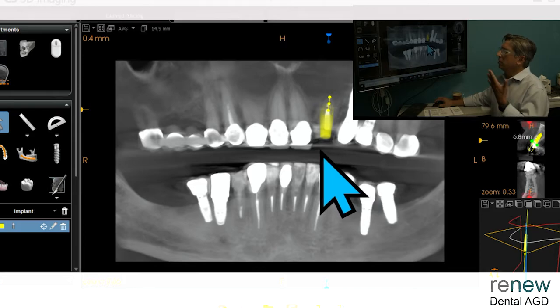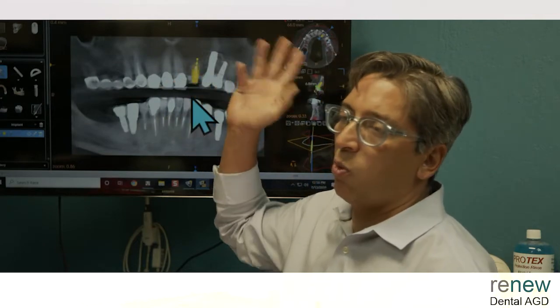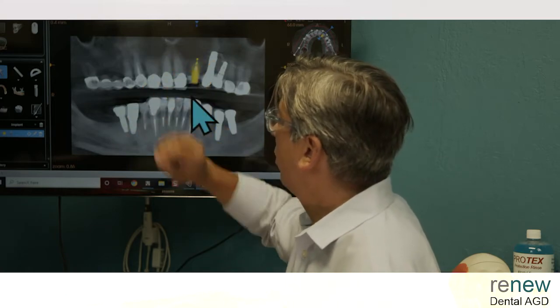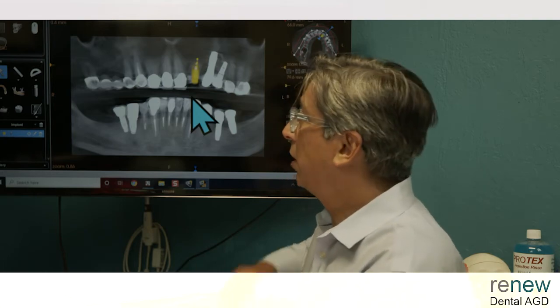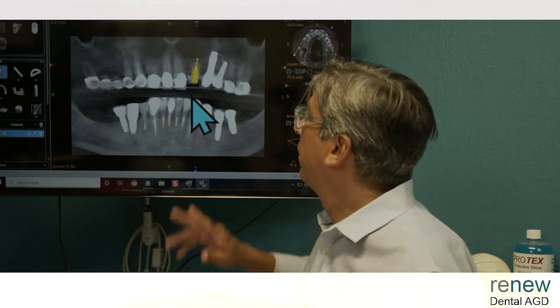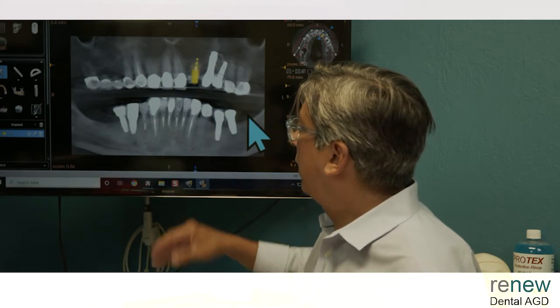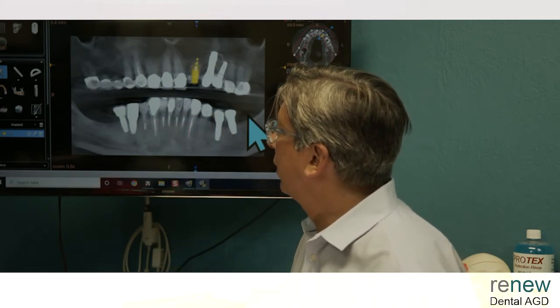So, like I said, there's a couple choices here. I think that they're both decent choices. One is going to be less favorable with dentists, if this is a patient watching it, and one is going to take a good 4 months if they do an immediate placement. If they do not do immediate placement, you're looking at a good 8-month project because you have 2 bone healing events: one for the graft and one for the implant. So that's a pretty straightforward case. The occlusion looks good, and they're pretty rock steady. Everything is porcelain on porcelain everywhere.